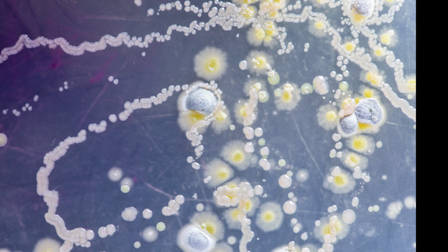Of course, if you test fastidious organisms, you should include some fastidious organisms. So maybe both Haemophilus influenzae and Streptococcus pneumoniae are good examples. For Streptococcus pneumoniae, you will have the alpha hemolysis. Haemophilus influenzae might be a bit difficult because you might have haze within the zone and so on. So this is again the same 15 people or something, maybe it's 12, that read plates from the same isolate. We now have 5 different antibiotics.